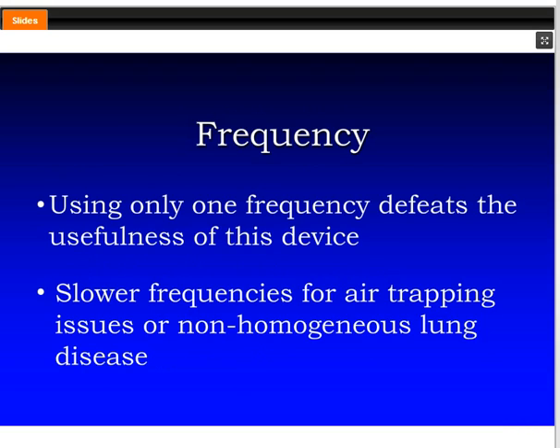Frequency, well, as I've said time and time again, if I only wanted a single frequency, I wouldn't have put a damn frequency knob on the ventilator. Using only one frequency defeats the usefulness of this device, and if that's the way you're going to use it, you probably shouldn't use the device. Certainly not for a lot of the lung diseases we use it for.